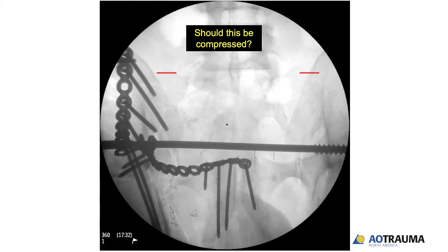I think you have to get some sort of compression, otherwise you're going to be locking in a fixed gap. Preoperatively, you can do a lot of templating for your anticipated screw length. You have an intact side to build back to. If you measure back to the midline, you get a sense of what double that would be to get your real screw length. Then when you measure intraoperatively, you can tell that it's going to be 10 millimeters longer, so I'm going to compress and add 10 or take off 10, whatever your sequence is. It gives you a good indirect way to build to what your length should be. But I do think you have to get some compression, and if you get the reduction, which looks pretty good with what Kevin's shown, that's going to be a safe compression.